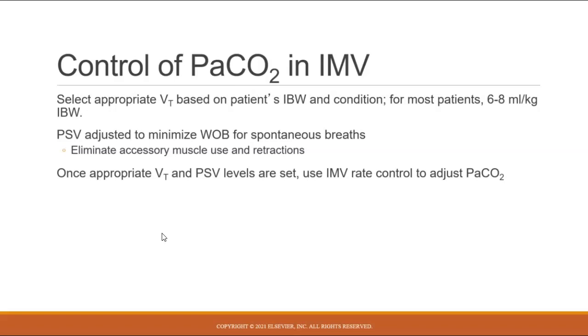We can also, when we're in IMV modes like SIMV, use pressure support to help minimize the work of breathing for those spontaneous breaths and achieve higher tidal volumes. Okay. So if I'm using IMV, when I'm making my settings and adjustments, I'm going to set my tidal volume to an appropriate level for the patient.